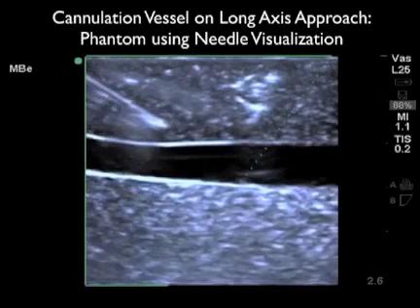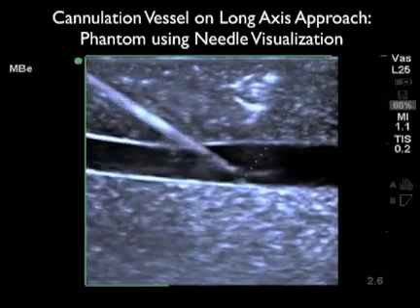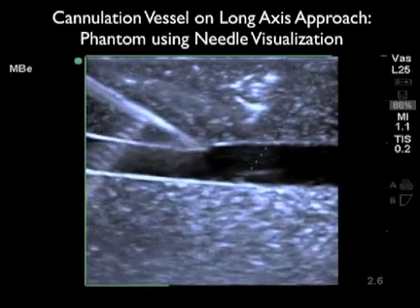In this video clip, we'll use the long axis approach for cannulation of a central vein. Here we're using some new technology known as MBE technology that is on a lot of the SonoSite machines.